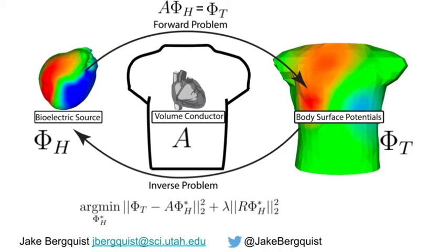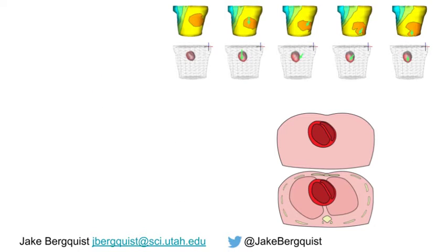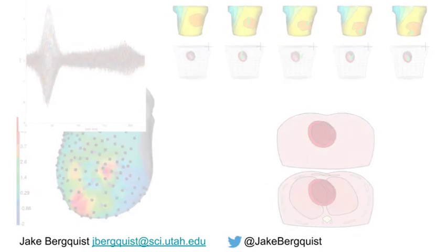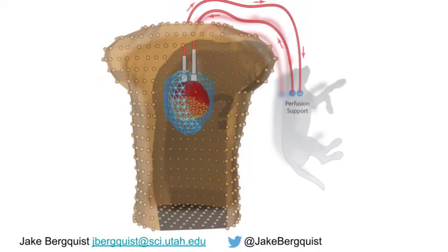Despite ECGI's clinical success, validation studies have been plagued by a myriad of controlled and uncontrolled errors, such as errors in the geometric model, heterogeneities in conductivity, incomplete sampling of the cardiac source, noisy signals, and a myriad of other sources. There's clearly a need for an experimental validation platform that controls as many of these errors as possible and allows for further development and validation of ECGI techniques.